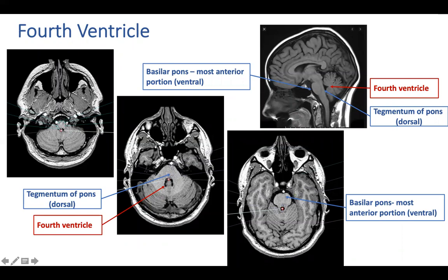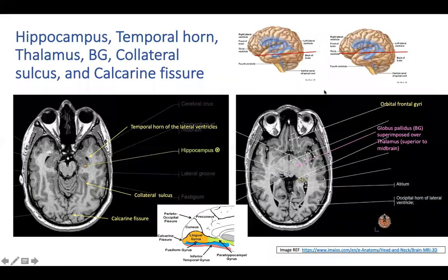Let's take a look at the fourth ventricle. Beginning at the base of the brain, you recognize the medulla, and at that level all you're looking at is cerebellum. You'll see a little black circle — that's the fourth ventricle. As you scroll superiorly and the pons begins to come in, the fourth ventricle looks kind of like an unhappy face. Recall the fourth ventricle is anterior to the cerebellum but posterior to the pons. As you continue scrolling superiorly to the widest level of the pons, you have the basilar pons — the anterior portion — and the tegmentum of the pons, which is the dorsal portion.